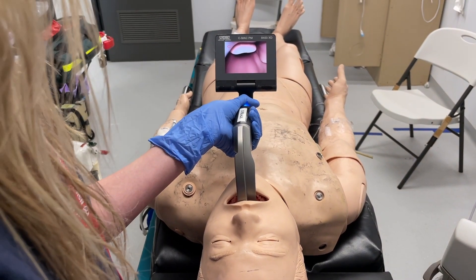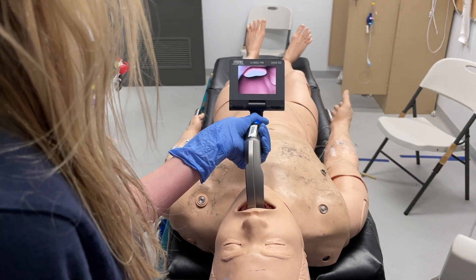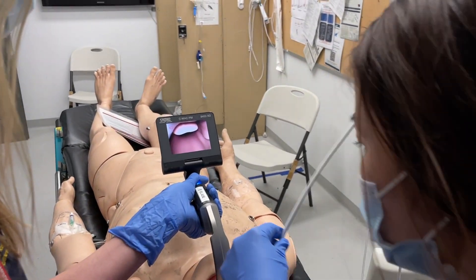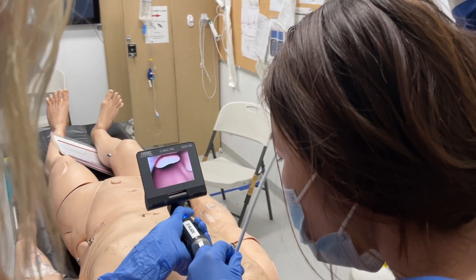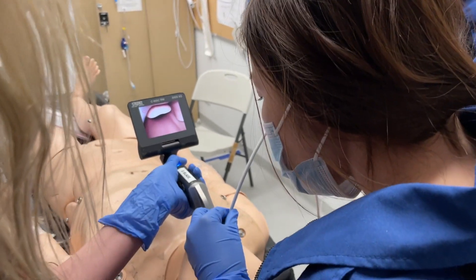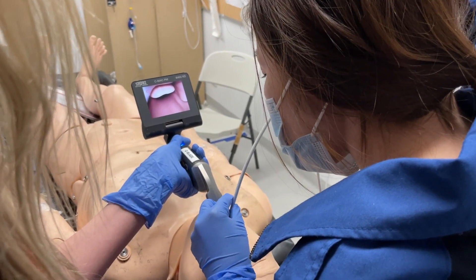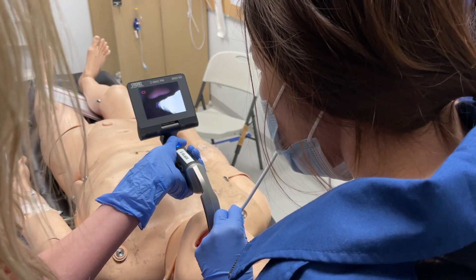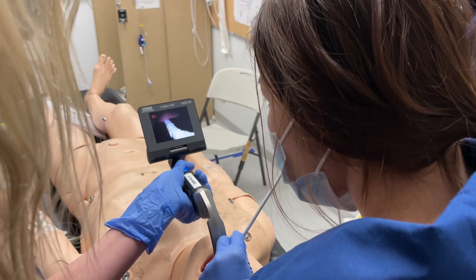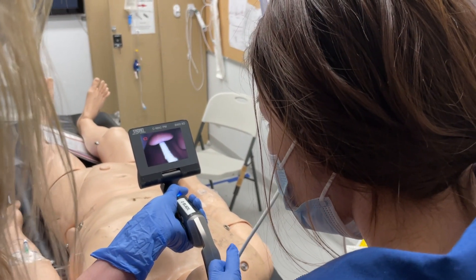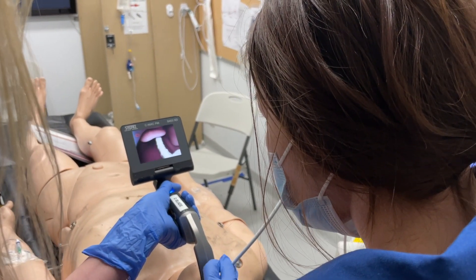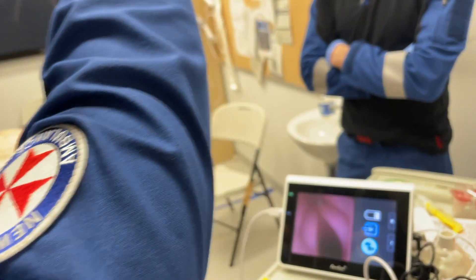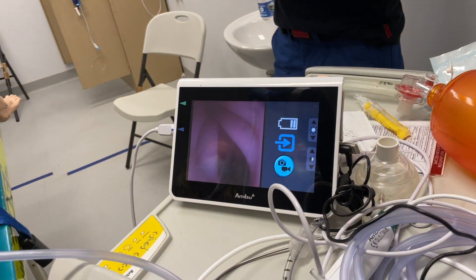Using a hyper-angulated blade, she'll now stand to one side. Our second operator with the flexible scope will go in, initially doing direct vision down the back of the blade, and then following the scope on the CMAC video laryngoscope screen.